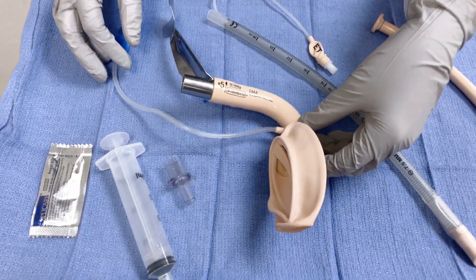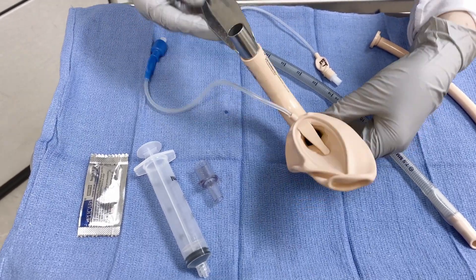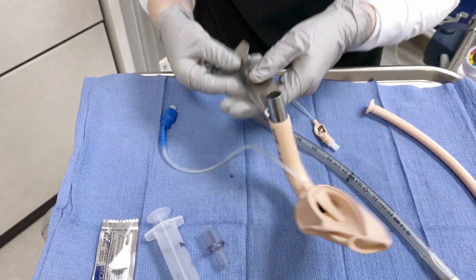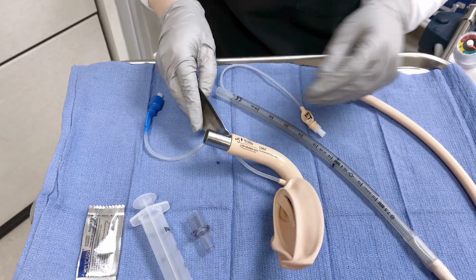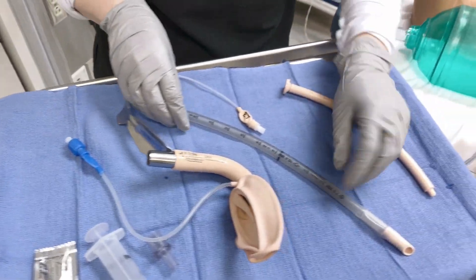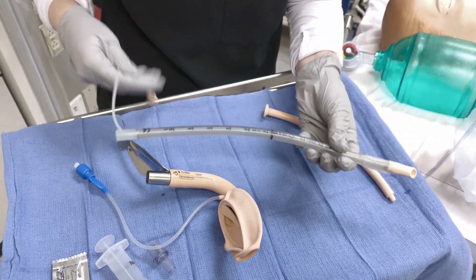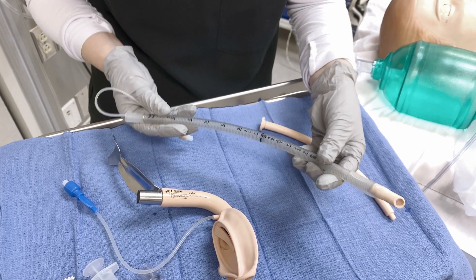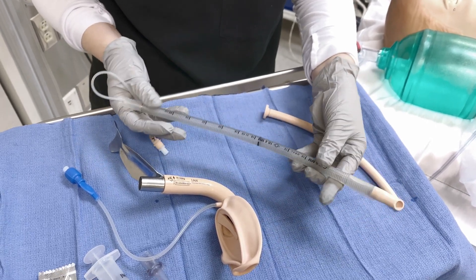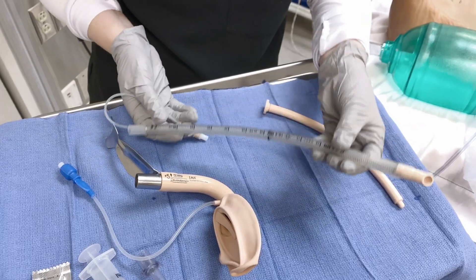First, you have the LMA itself, which is a rigid curved LMA tube that has a handle attached, which allows for one-handed insertion of the LMA, and this is a cuffed LMA. You also have the dedicated silicone ET tube that is also cuffed. This comes in the kit with the LMA tube and ranges in sizes from 6.0 to 8.0.